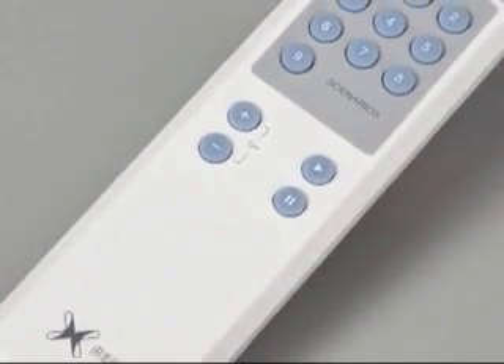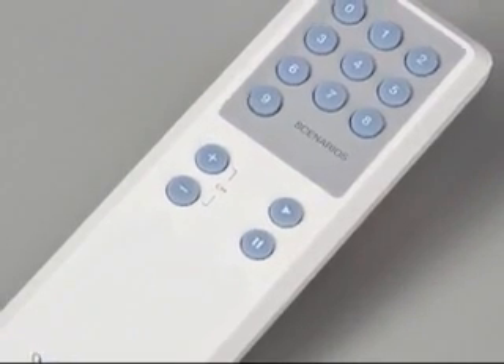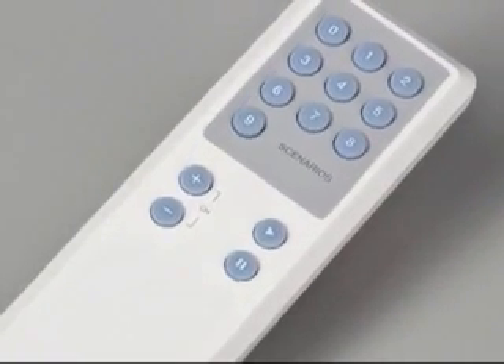Lastly, the remote control allows the instructor to make changes while standing several feet away from the device as students are using it.